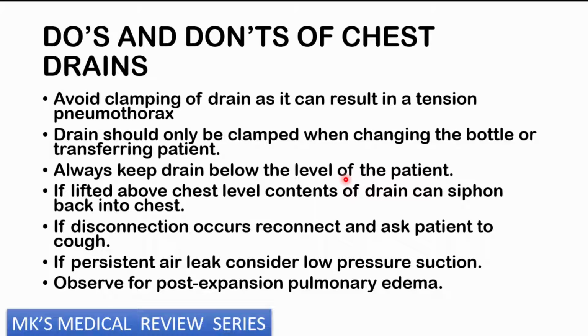So avoid clamping the drain, as this can lead to tension pneumothorax. The drain should only be clamped when changing the bottle or transferring the patient, and always keep the drain below the level of the patient, below the level of the insertion. If it's lifted above the chest level, the contents are going to be draining or siphoning back into the chest. If a disconnection occurs, reconnect it and ask the patient to cough.